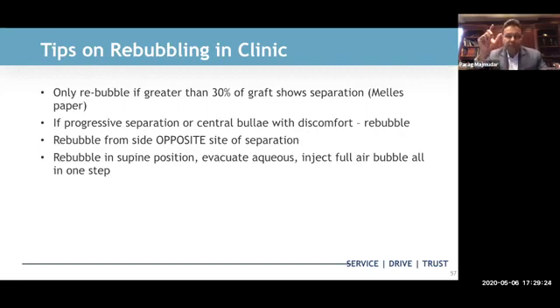I will put a speculum in right at the slit lamp, and I have a little cannula that I'll use, and I can put SF6 or air right at the slit lamp. And it's very, very easy. Patients are not in any discomfort, right?